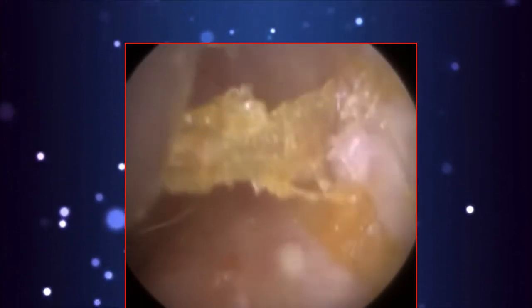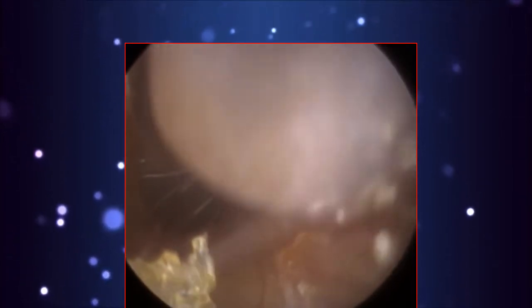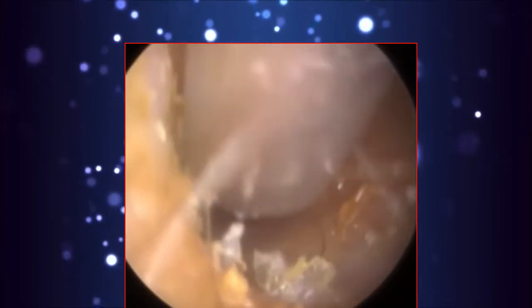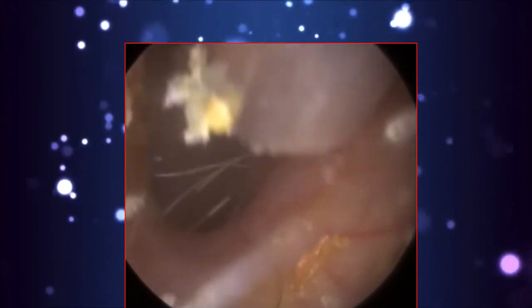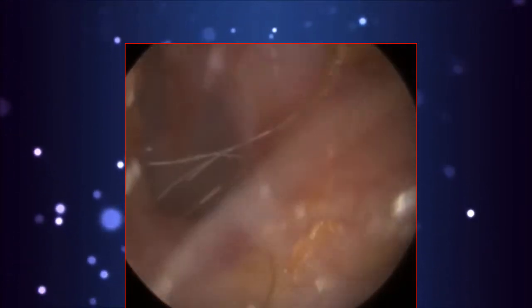And the patient did feel it. Now, it wasn't massively uncomfortable, but the patient did move. And looking back, I should have just left it, as it wasn't going to cause massive issues. I thought I had enough space to gently remove it, and you can see there's hairs there, and these forceps that I use, they are micro forceps. They're the smallest ones. You get different sizes, and these are the micro ones, with a fine jaw as well. On camera, you might think that looks really big, but remember, guys, this is magnified considerably. They are the most minute of forceps we use.